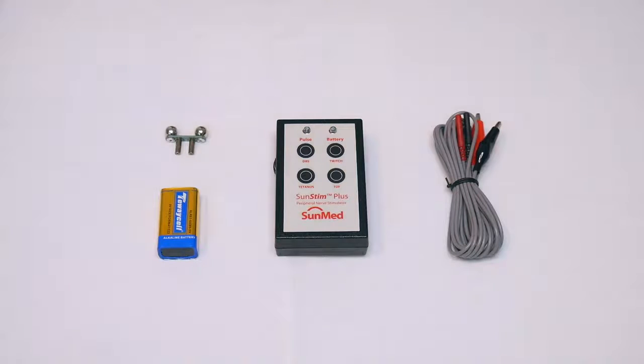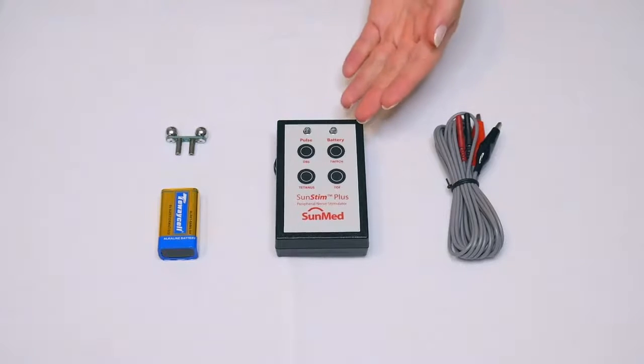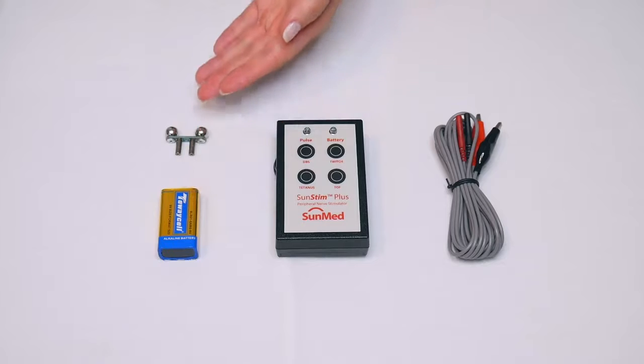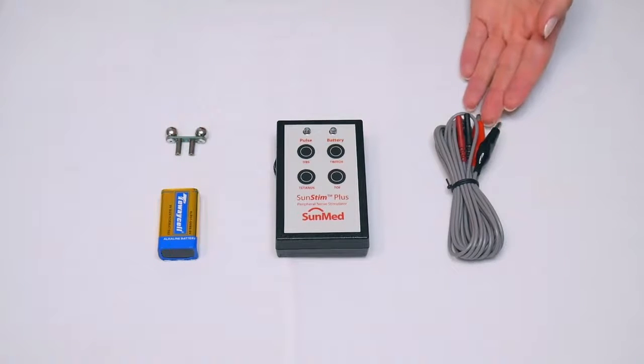In this video, I'm going to be demonstrating how to use the AirLife SunStim Plus Nerve Stimulator. In the box, you will receive the SunStim unit, a 9-volt alkaline battery, stim ball electrodes, and extension lead wires.